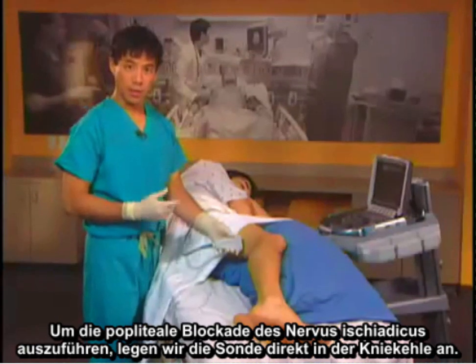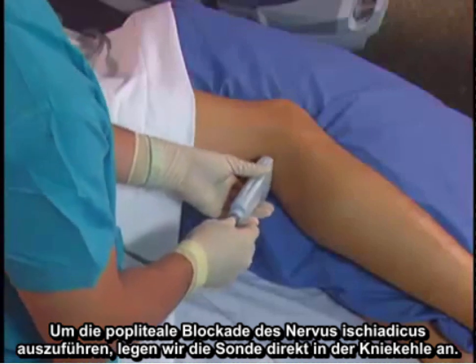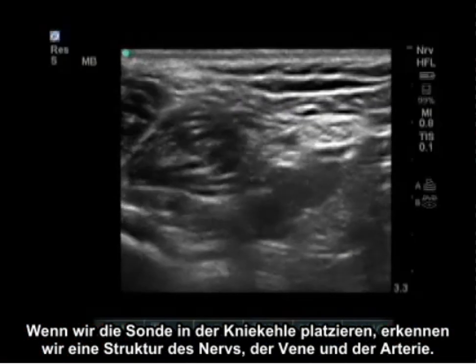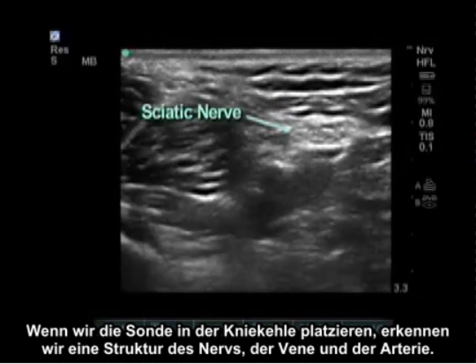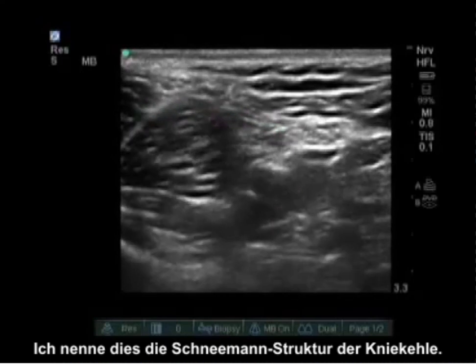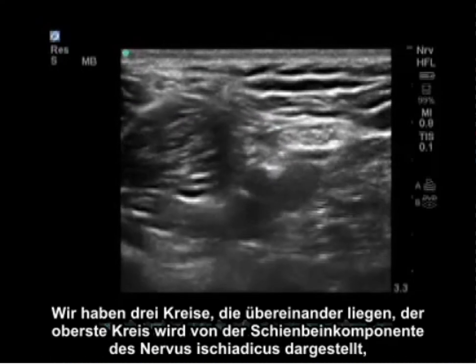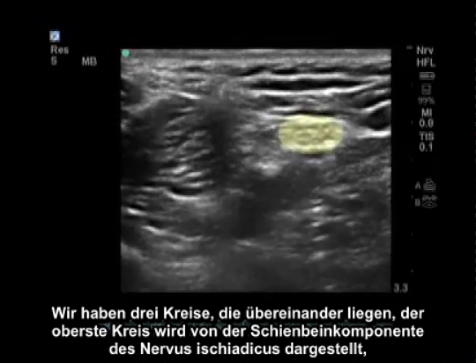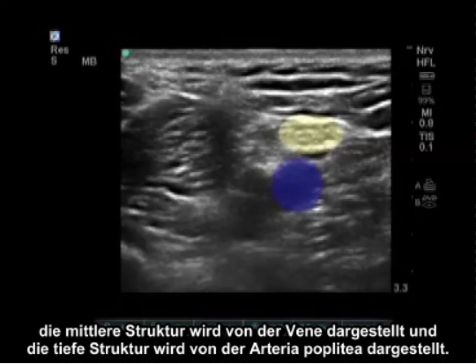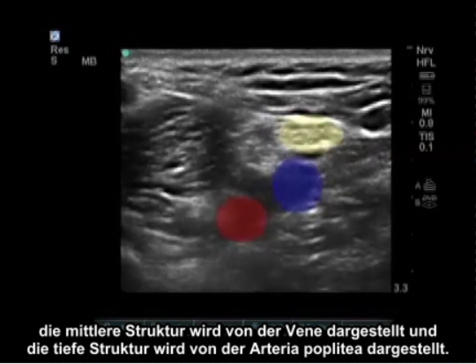To perform the popliteal sciatic nerve block we put the probe directly in the back of the knee. Placement of the probe in the back of the knee reveals the nerve, the vein, and the artery. I call this structure the snowman in the back of the knee — three circles on top of each other: the uppermost circle represented by the tibial component of the sciatic nerve, the middle structure represented by the vein, and the deep structure represented by the popliteal artery.